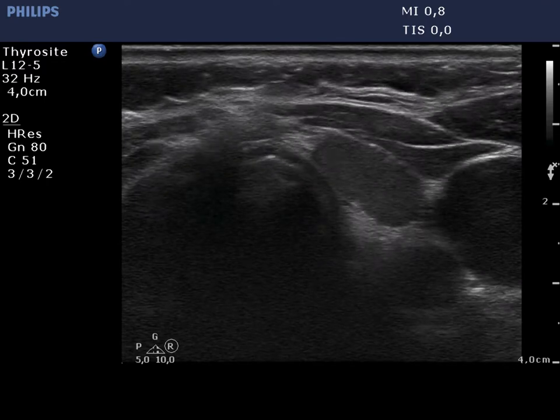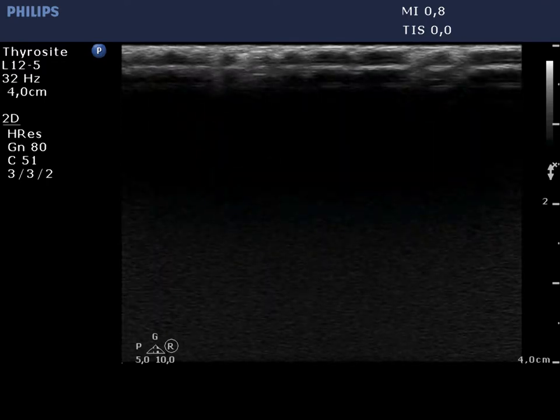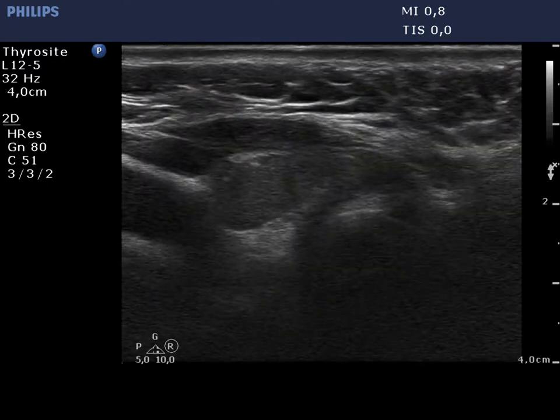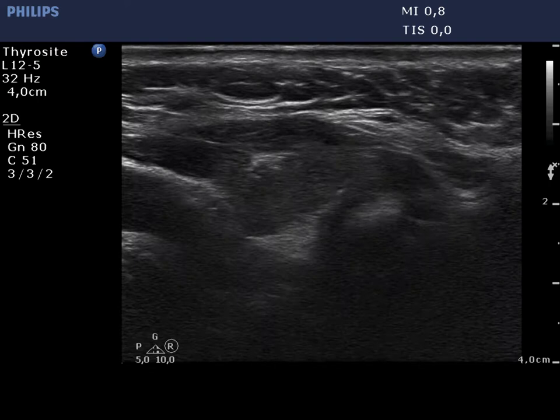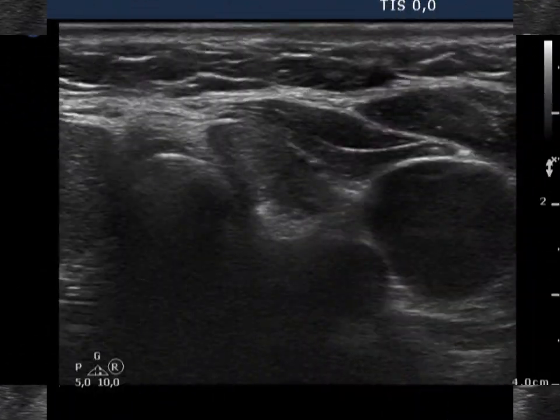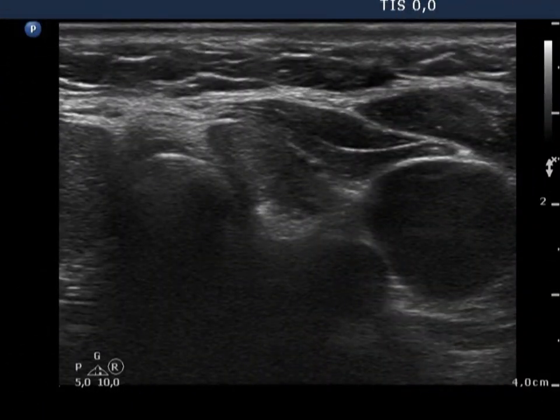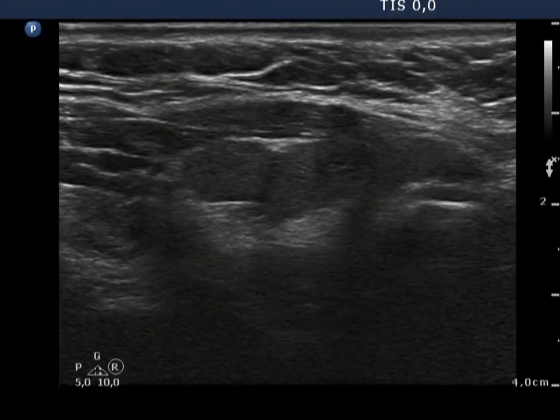The left lobe has an identical appearance. It is very important to avoid overrating discrete lesions in an operated thyroid. The lesions demonstrated in this case are not nodules in a pathological sense.